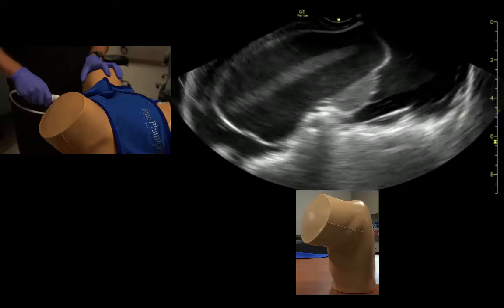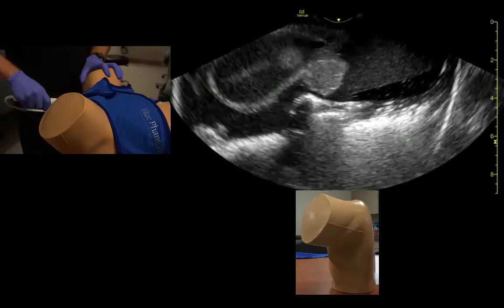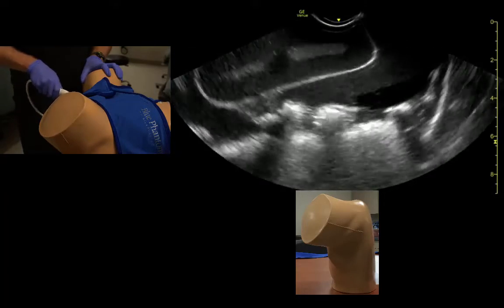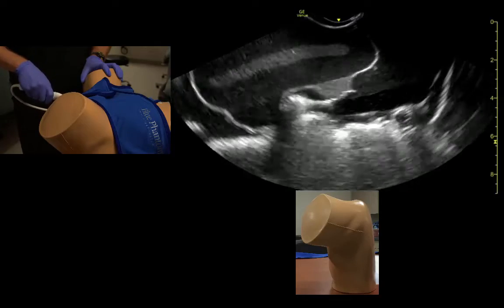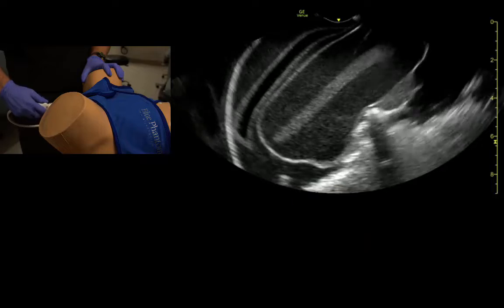Frequently, to see the posterior cul-de-sac, we need to point towards the floor and fan from side to side again. We always come back to the midpoint, and from there we'll go to coronal views.